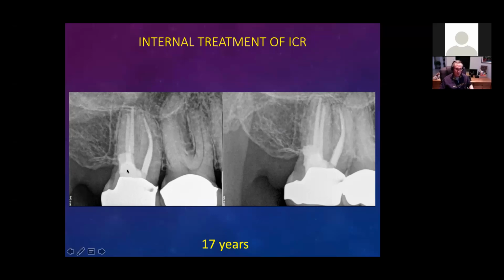When they come back, then after having calcium hydroxide in there a few weeks, things are dry and you can see what you're doing. And so then I'll fully prepare the canals. I'll do some more debridement with a burr, and when you do that, it starts bleeding again a little bit. But then when you apply the acid, it cauterizes and stops it. And it takes usually somewhere between 3 to 5 appointments to treat these internally until the calcium hydroxide expands and fills the whole space. And then that's when we finish them and obturate them.